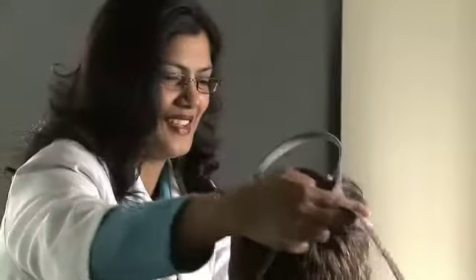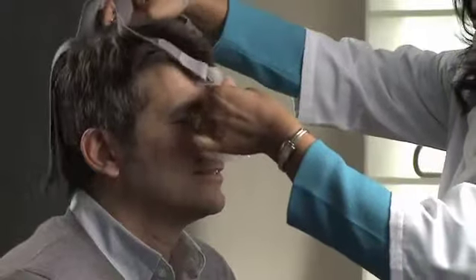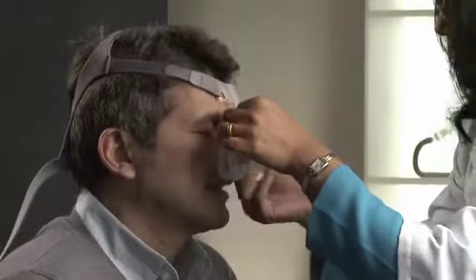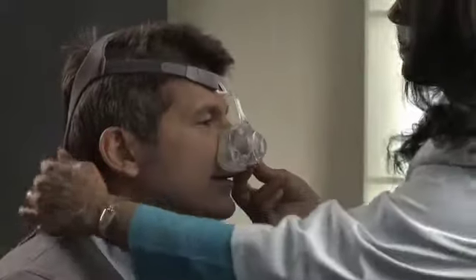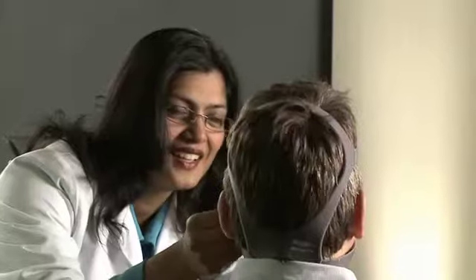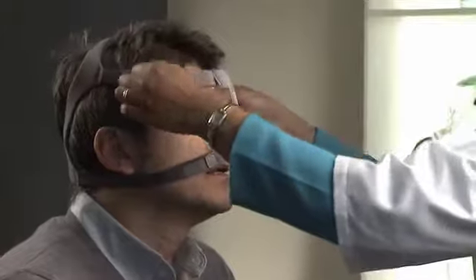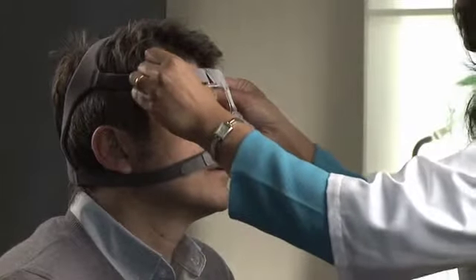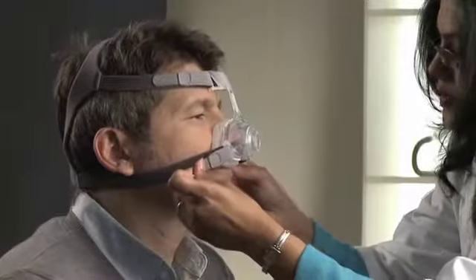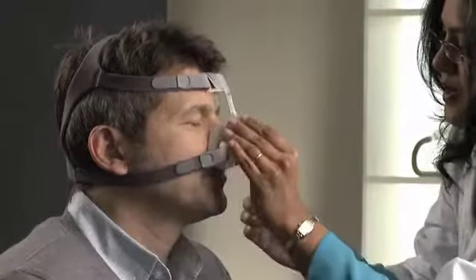With both lower headgear straps released, hold the mask against the face and pull the headgear over the head, bringing the lower straps below the ears. Loop the headgear into the lower hooks of the mask frame. Unfasten the velcro and pull the upper headgear straps evenly until they are comfortable, then repeat this step with the lower headgear straps.